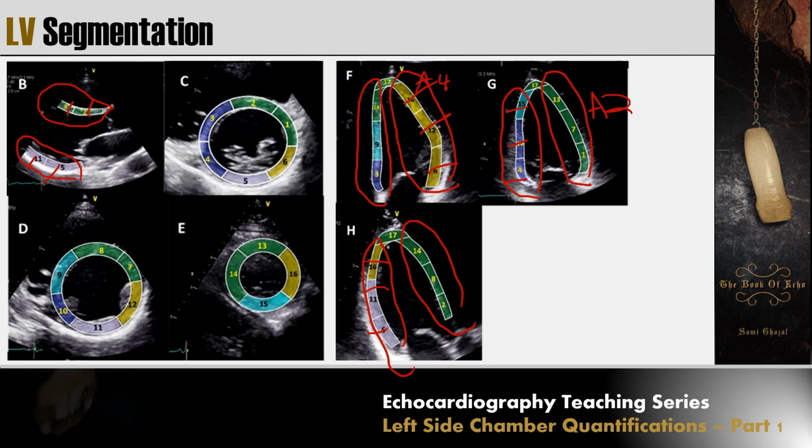and again, here it is very important to determine where the septum is. So this is the RV here. The septum starts from here to here. So this is the septum. It means that this wall is the anterior wall. So don't make the mistake of saying this is the anterior wall. No, this is septum, because this is the RV.